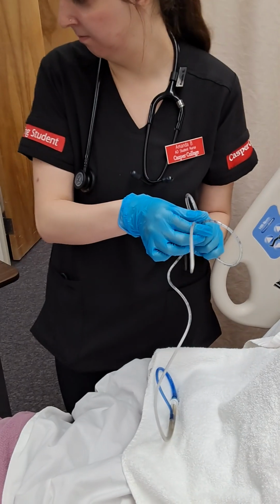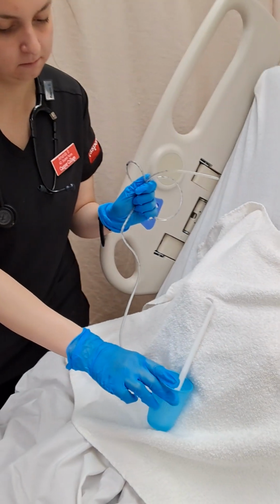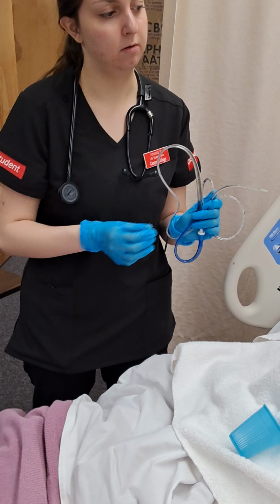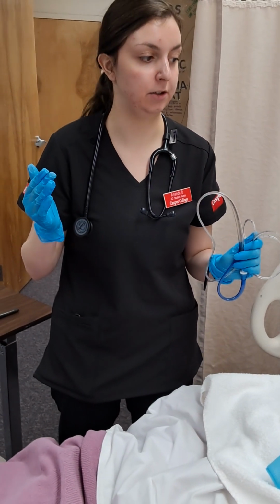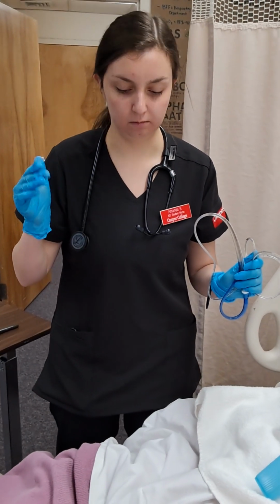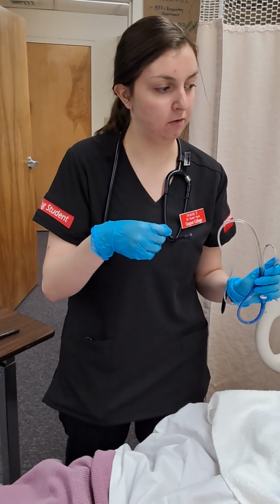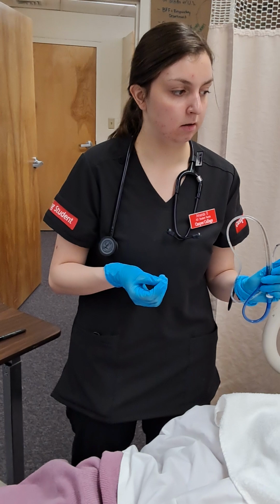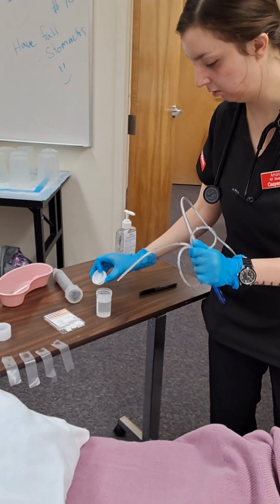Okay. So I'm going to give you some water. So when I initially insert the tube, his head is going to be in a neutral position, and then once the tube advances, I will have him lean his head forward, bring his head to his knees, and sip from the straw. Sip the water from the straw. Okay, now I'm going to lubricate my tubing.